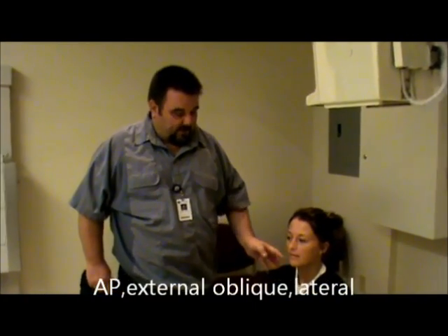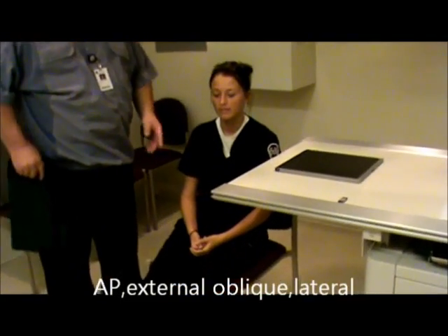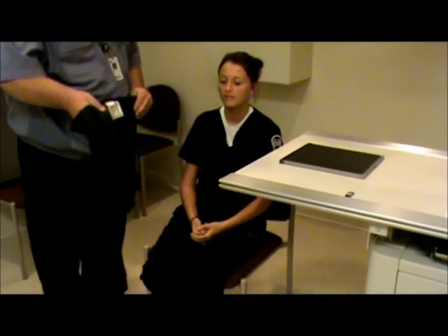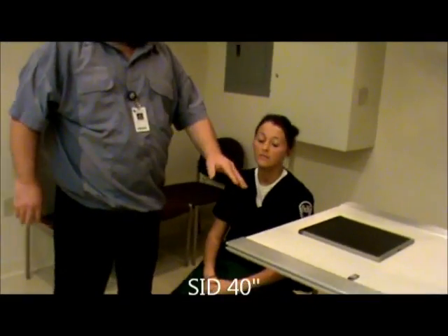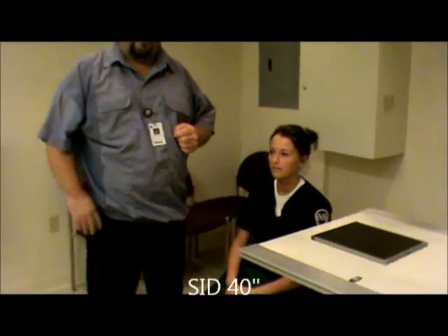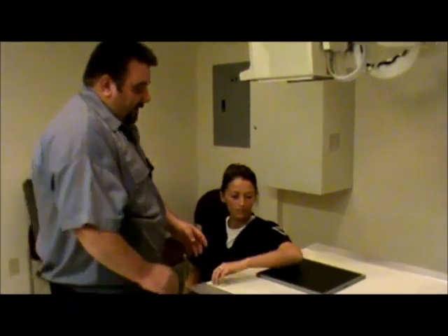First, we want to have the patient come in seated at the end of the table with the legs out to the side because of radiation safety issues. We'll place a shield across the patient. We do want to have the table raised so that we can have everything in the same plane from the shoulder down. We're going to have the patient put their arm up here, palm up.